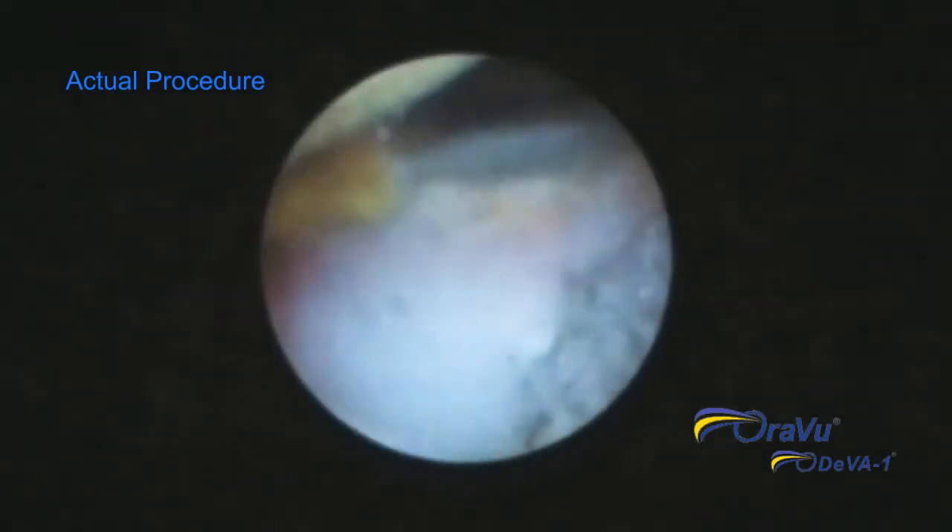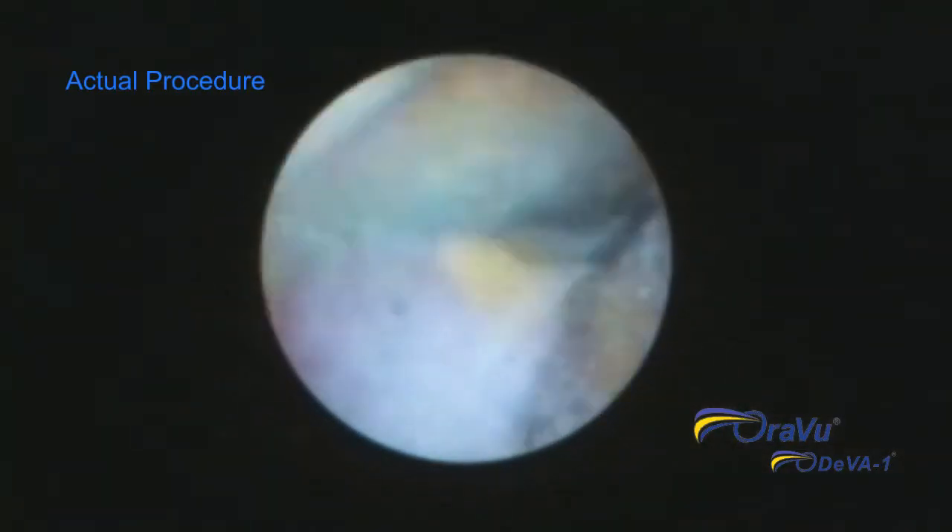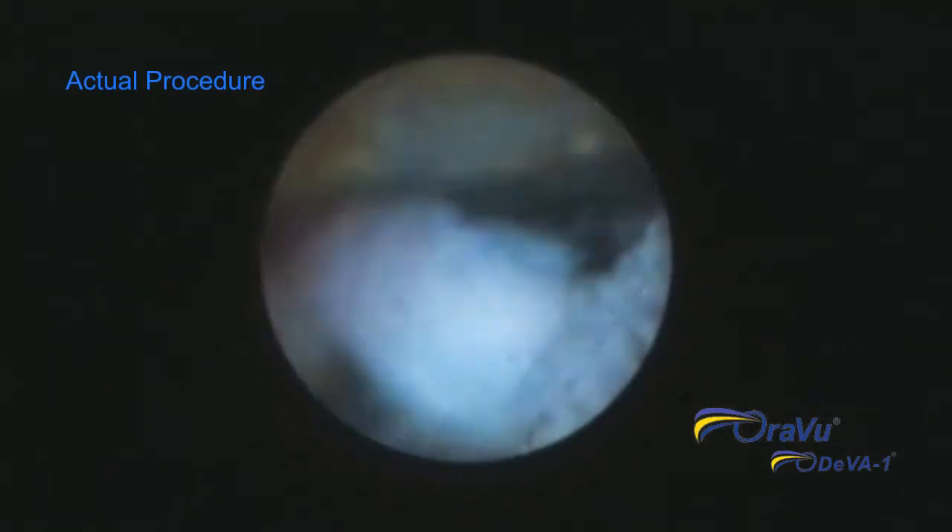Without the DIVA-1, the dental hygienist is removing calculus in the blind. Because it is only a tactile procedure, the hygienist only knows the surface is smooth, not completely debrided.